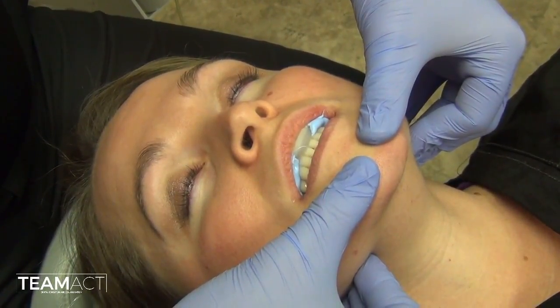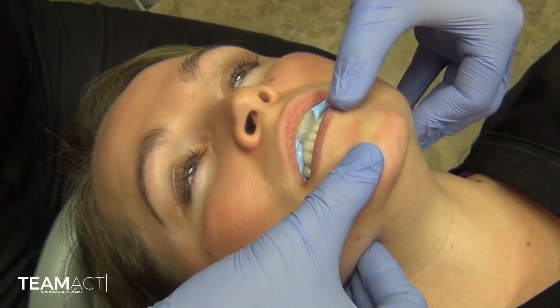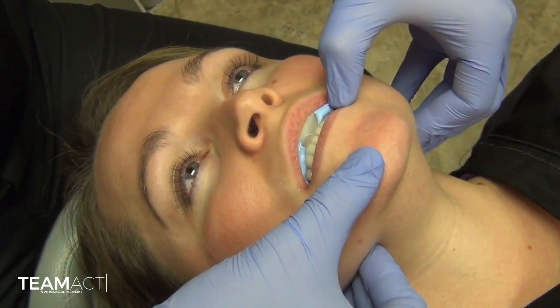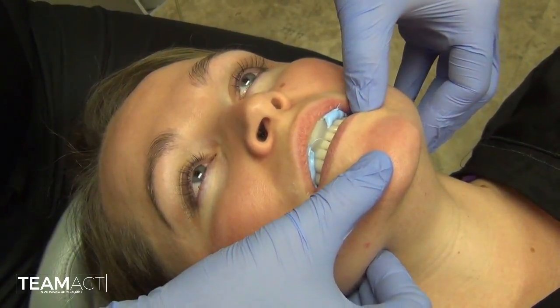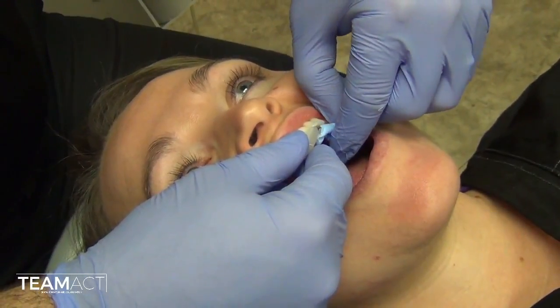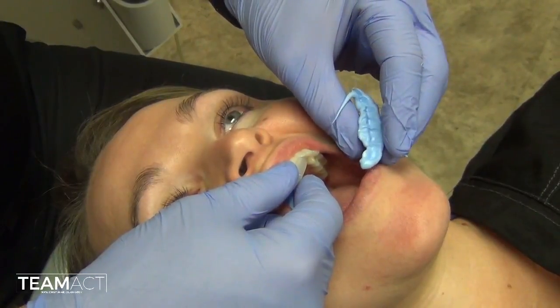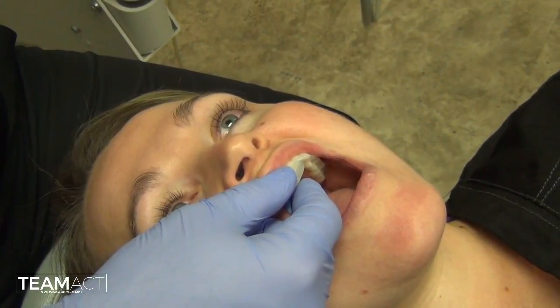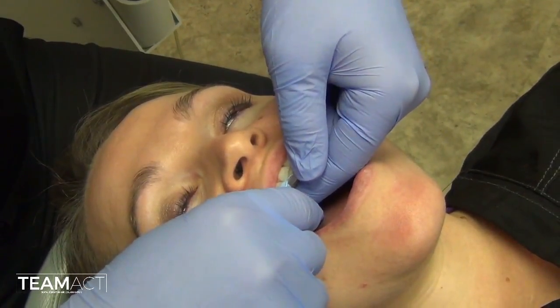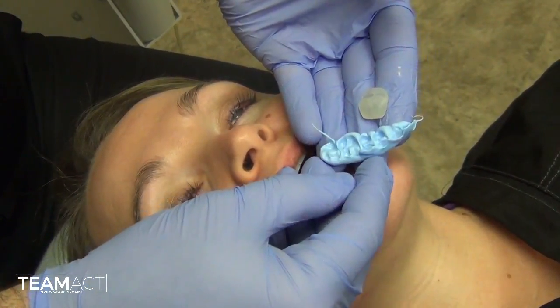This material takes about 35-40 seconds to fully set. Once it is set and firm, I will remove the records from her mouth and proceed to trim the records appropriately. Sometimes you can actually see where that CR first tooth contact is due to the thinness of the material in that area.